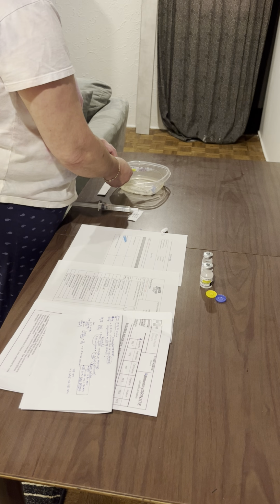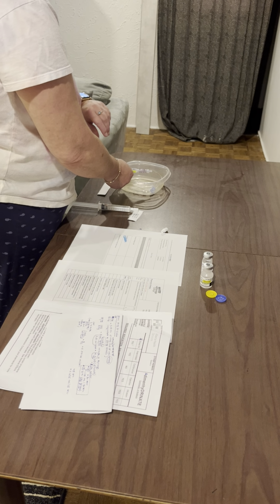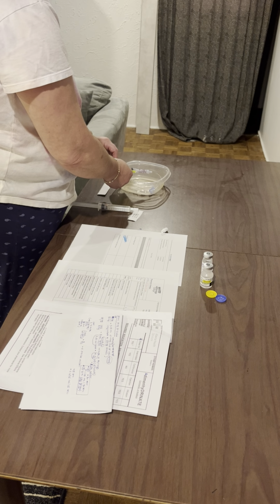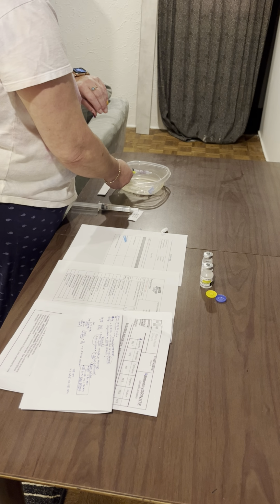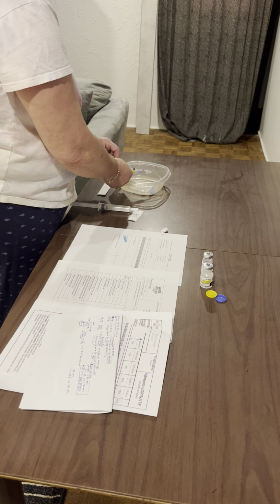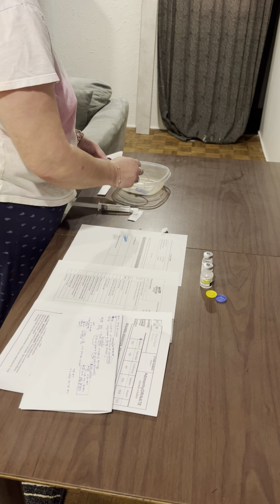Okay, then we're going to go from 3 to 2. Okay, and wait another 30 seconds. From 2 to 1. And wait another 30 seconds. And then from 1 to the end. Okay, so the medication has been given and the patient has tolerated this well.